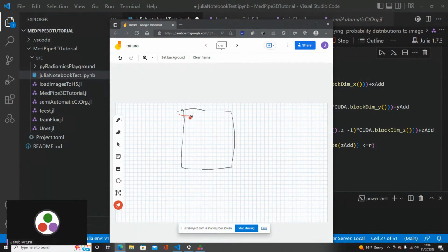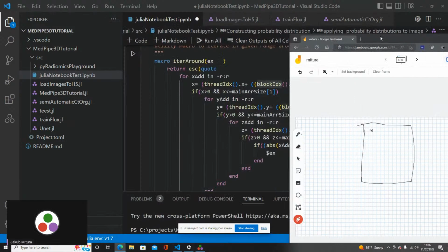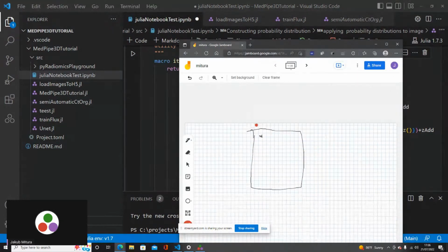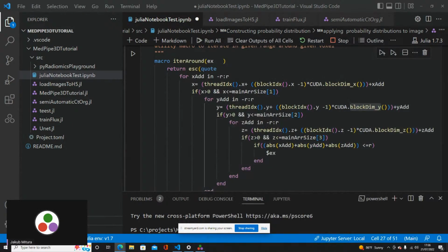So in order to do this, we use this thread ID X, block ID X, block dimension X, Y, and Z. Yes. When we know where we are, we can load the data from around in order to get these sparse statistics from each voxel, as I explained earlier.